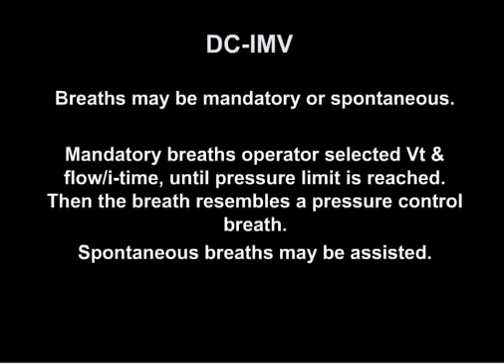Dual control IMV. With dual control IMV, breaths may be mandatory or spontaneous. Mandatory breaths are operator selected tidal volume and flow/I time until the pressure limit is reached. Then the breath resembles a pressure controlled breath. Spontaneous breaths may be assisted.